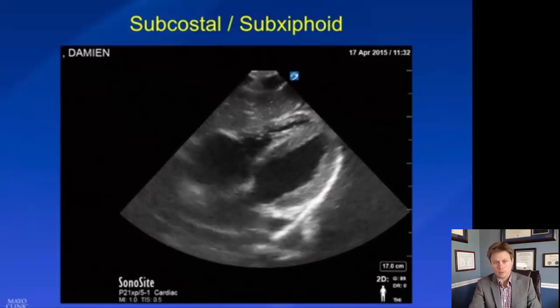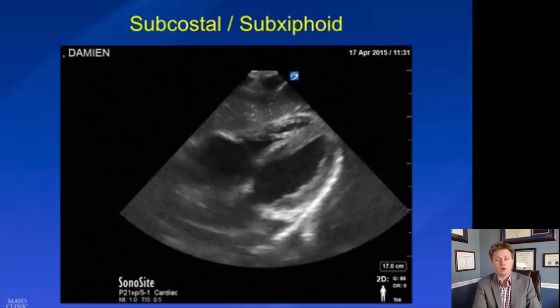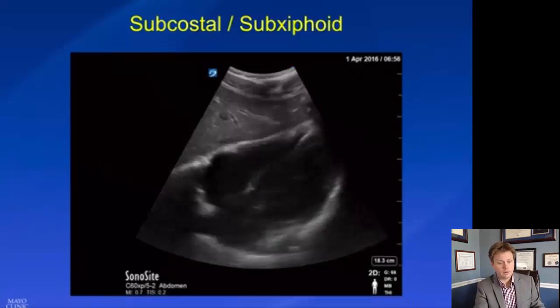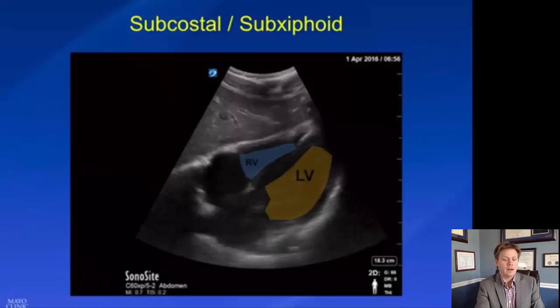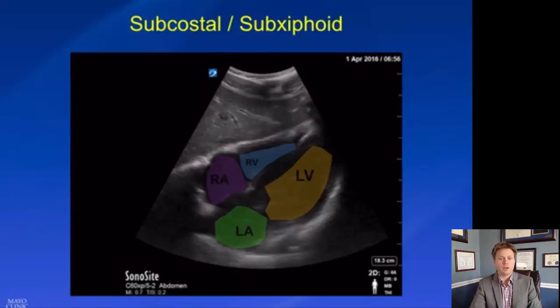And the very first thing that we'll see after the liver is going to be the right ventricle, right? Because that's what the base of the heart sits on, the diaphragm. So we see the right ventricle on top, which means that the left ventricle must be the other one, and both of their corresponding atria. Now, this is nice because in most cases we can get a relatively good 4-chamber representation of the heart, which is a lot easier to obtain in most cases than the traditional apical view. You can't do some of the other more advanced quantification functions or Doppler studies that you can.